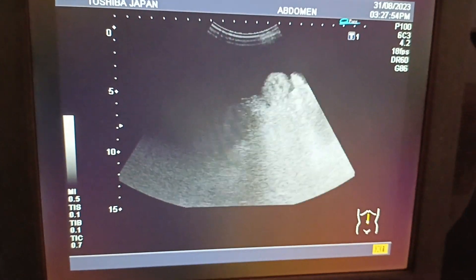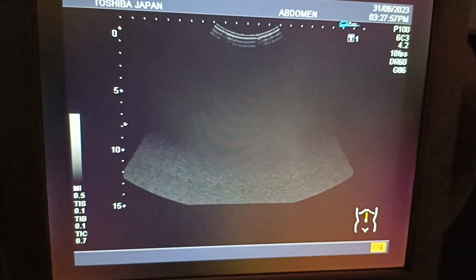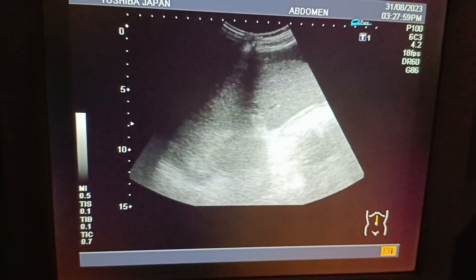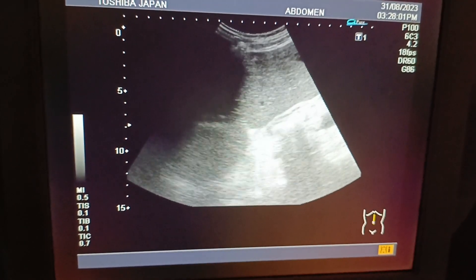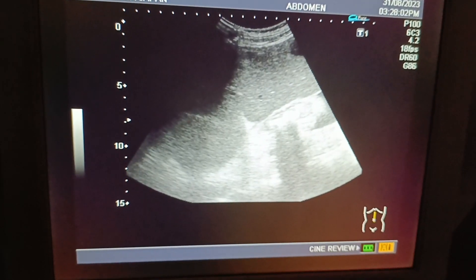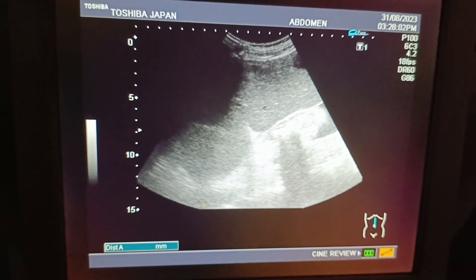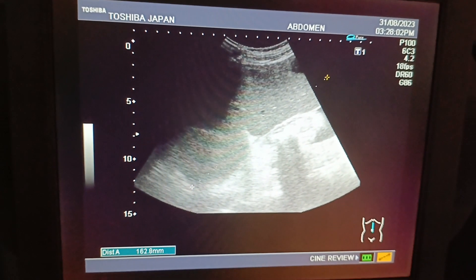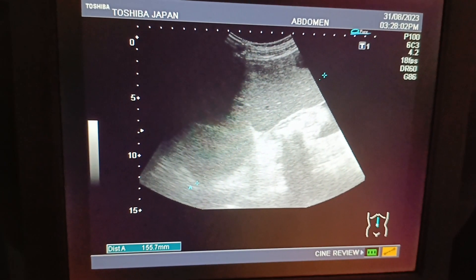You can see the gallbladder, which contains multiple stones with a thick wall.